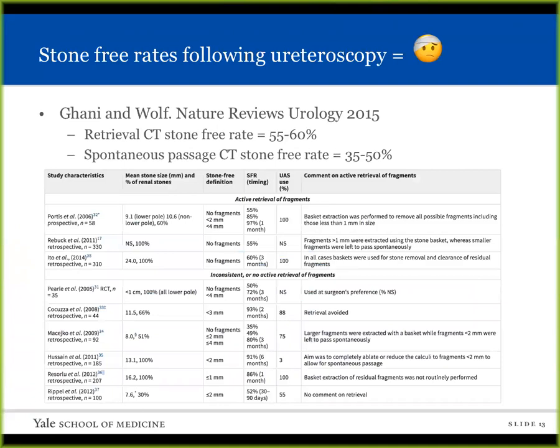Regardless of the method or technique of stone surgery, stone-free rates following ureteroscopy have been subpar. A review by Ghani and Wolf that was published in Nature Reviews Urology in 2015 looked at studies that looked at CT stone free rates.